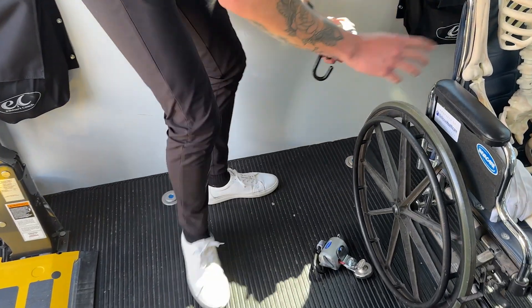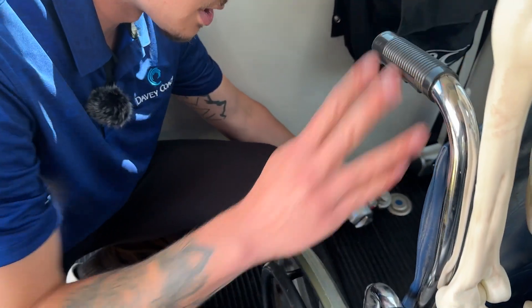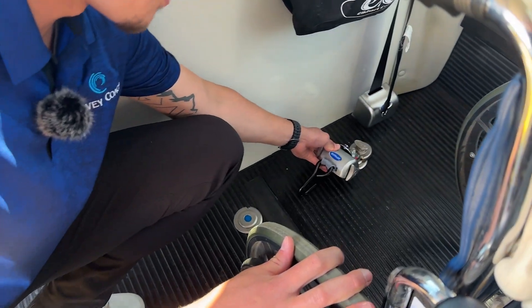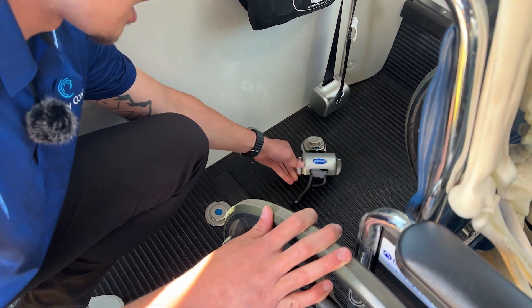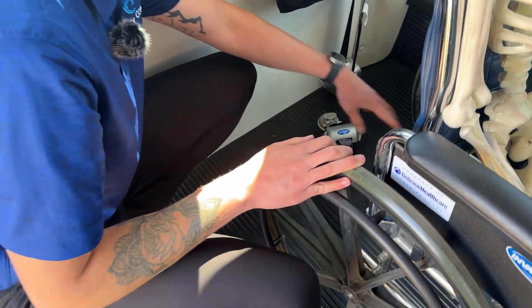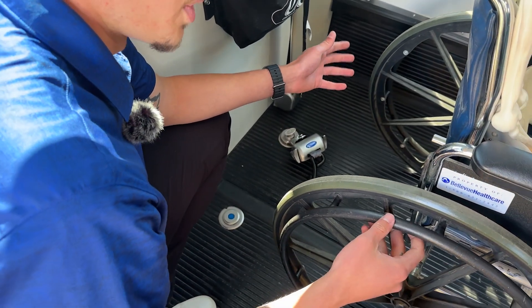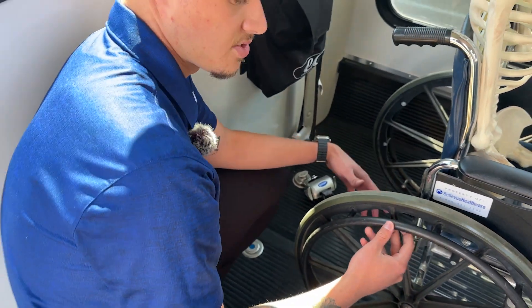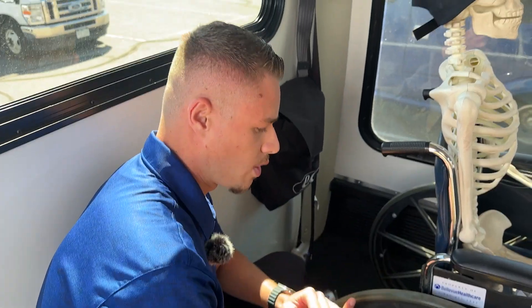We'll go ahead and secure the wheelchair securement to the slide and click puck, starting at the very back corner of the wheelchair itself. We'll slide it in — it's already locked. Then we'll secure it to the wheelchair. When securing a wheelchair, you always want to attach the securements to the welded points of the frame.